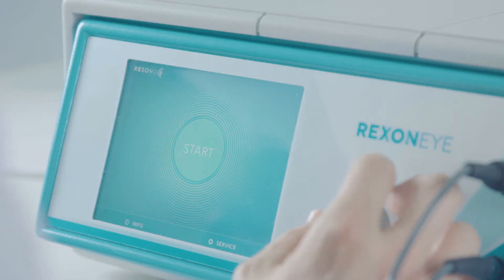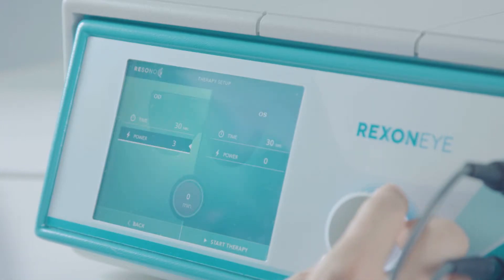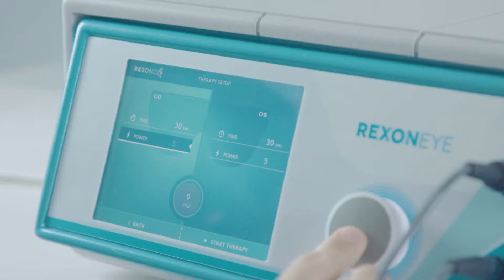Exit the standby mode by rotating the knob and press it to enter the therapy setup. Here you can set the parameters for each electrode, such as duration of stimulation or deliver power. Press the knob to select the item and then, by turning the knob, set the value. Finally, press the knob again to confirm.